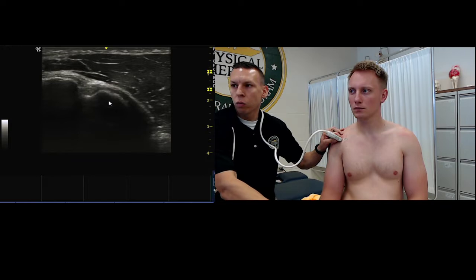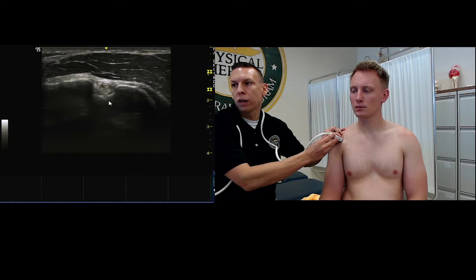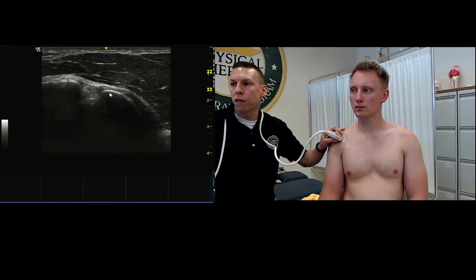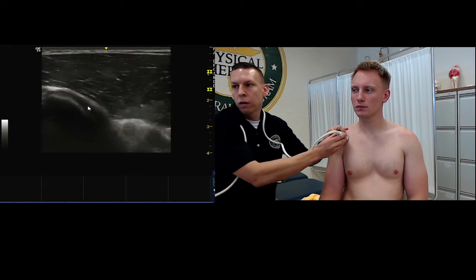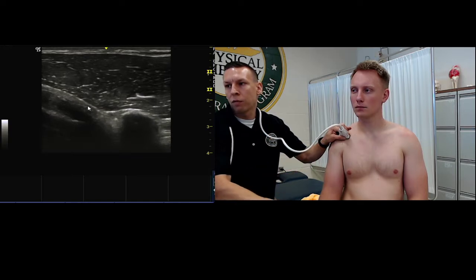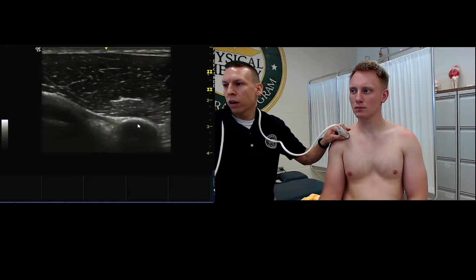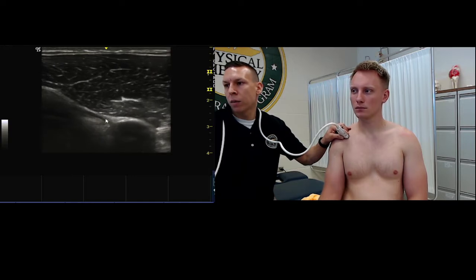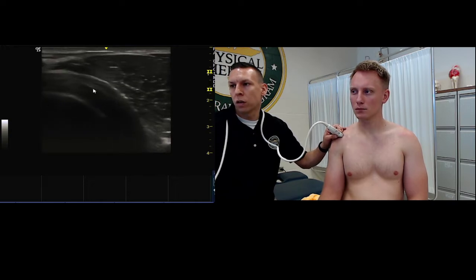From right here, once we're in this bicipital groove, your bony acoustic landmarks are right there. We're back at home base. We're going to look at the subscapularis, which is going to be coming off the lesser tuberosity. It attaches there, and so that's this structure right here. If we keep moving medially and come up a little bit, you can find the coracoid here, and it slides underneath that bony structure. Right here is the coracoid. You can even start to see some of the coracohumeral ligament here on top if you move more cephalad.